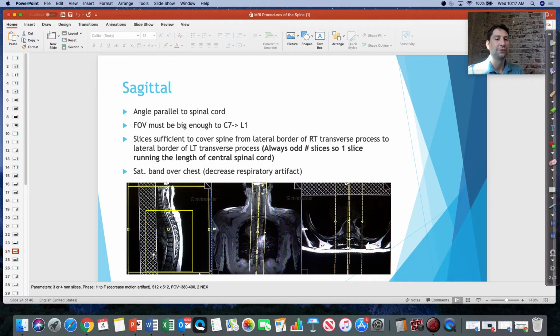Then, for our actual sagittals, that's when we want to reduce our field of view so that we're really just covering the thoracic spine. So now we've covered C7, and then we go all the way down to L1. That way, the radiologist knows we covered the correct area, and we have all the thoracic vertebrae in there. That's typically why we send our localizers. The rads are looking to make sure everything was set up appropriately, and for any incidental findings. Sometimes with those localizer scans, they might see a tumor off to the side, say in the brachial plexus. Even though you're doing the C-spine, they see that, and then they'll call and say, can you run a brachial plexus scan also, or they'll have the patient come back and get a scan another day.